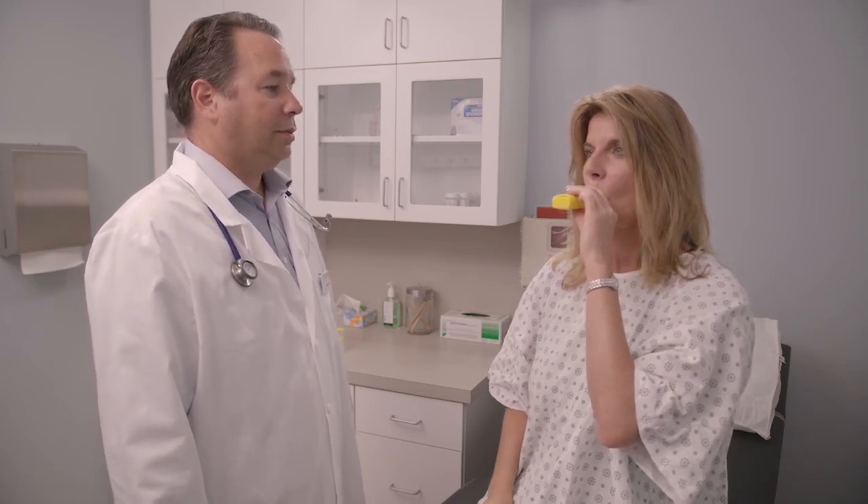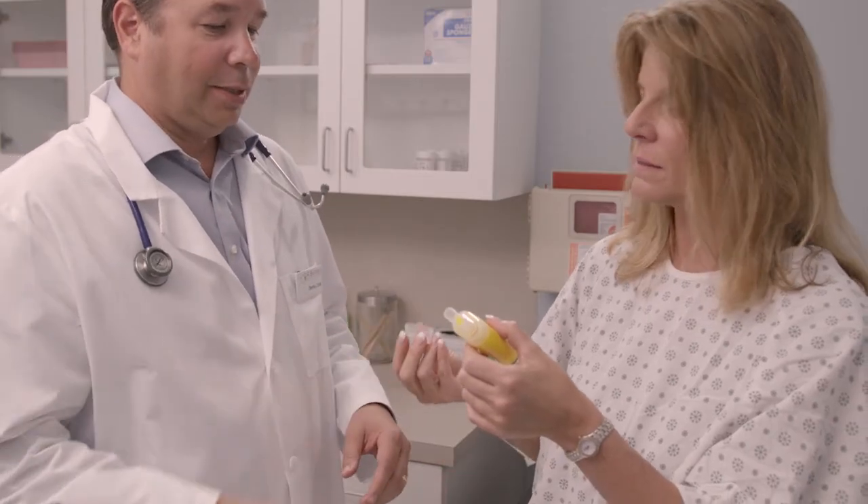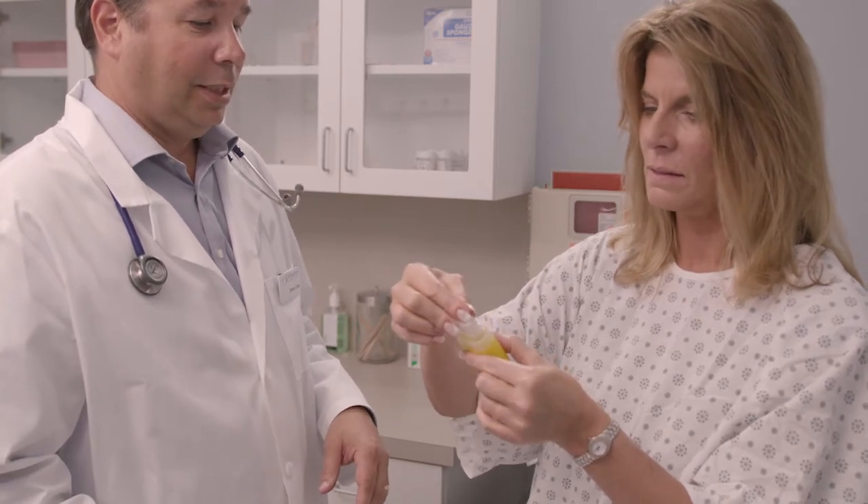Use the Pocket PEP as often as your healthcare practitioner tells you to. Keep using it even if you are only bringing up a little mucus. Keep the OPEP mouthpiece covered with the dust cap when you are not using it.